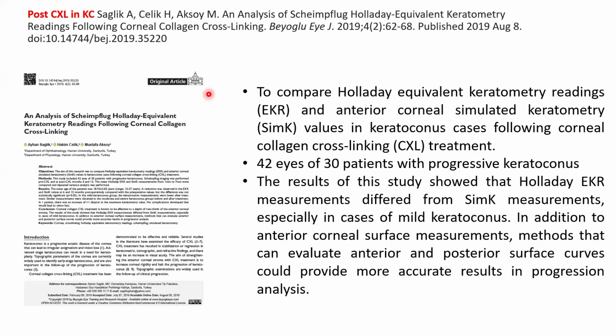They studied 42 eyes of 30 patients with progressive keratoconus, and the results showed that the Holladay EKR measurements differed from the SIM-K measurements, especially in cases of mild keratoconus. In addition to anterior corneal surface measurements, methods that can evaluate anterior and posterior surface curves could provide more accurate results in progression analysis. So there is a role of EKR values in finding out the progression of keratoconus post CXL as well.